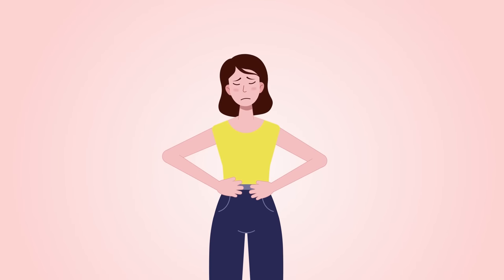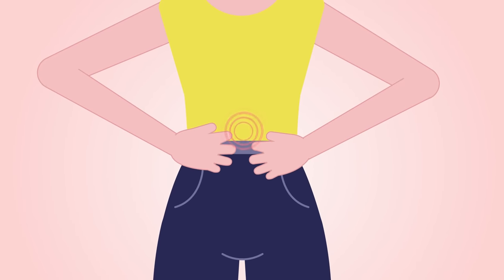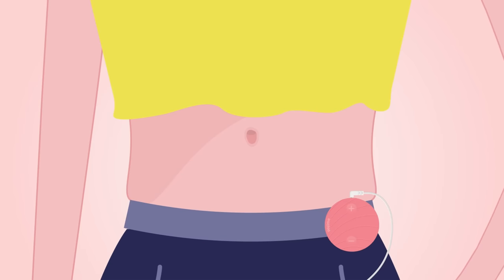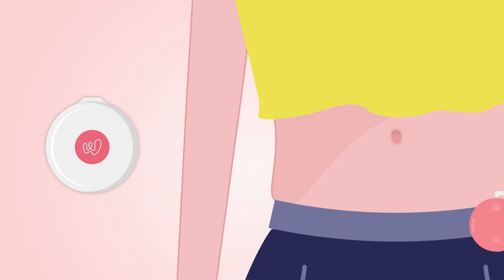To use Wellme, you gotta have a period. And when you do, find the spot that pains the most, then follow these simple steps. Wear the device on your waistband. Remove the transparent film from the electrode patches. Keep it safe to stick the patches back after the therapy.